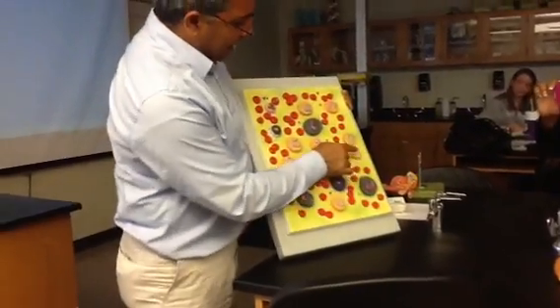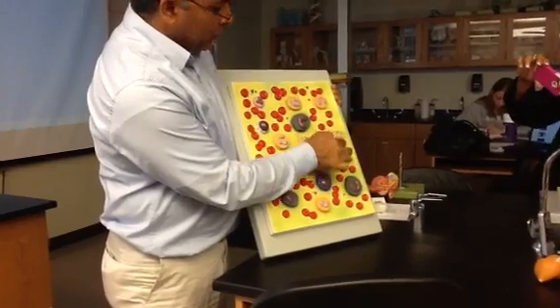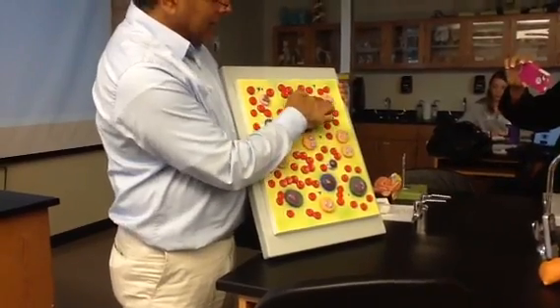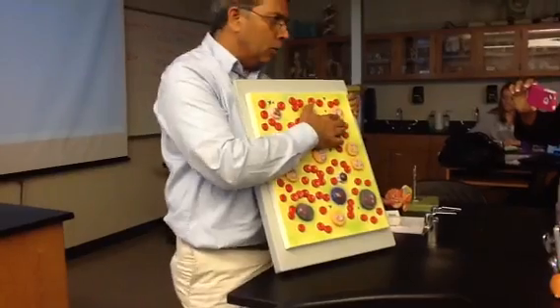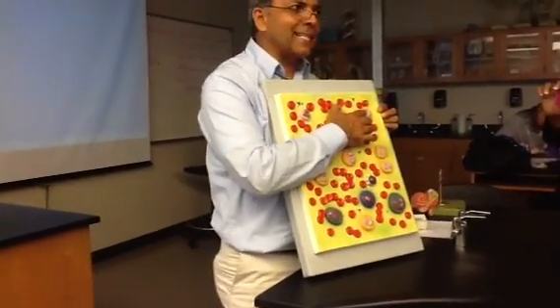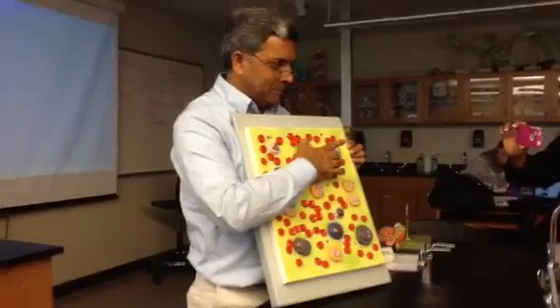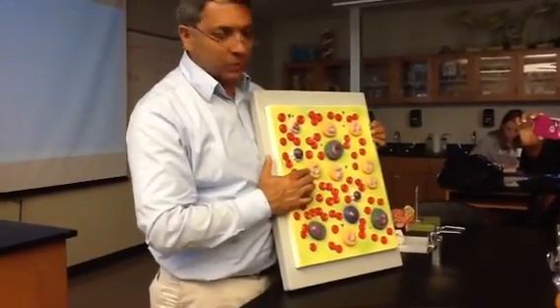Now if you look at this cell here and this cell here, these are neutrophils. Why? Because they do not have orange-red granules. In addition to this, look at this cell. Now look at the cytoplasm. You see orange-red granules. So this is an eosinophil that is raised in levels when there is a parasitic infection, or if somebody has a severe allergy, or if there is a drug reaction. Neutrophils are raised in the blood, usually in bacterial infections.